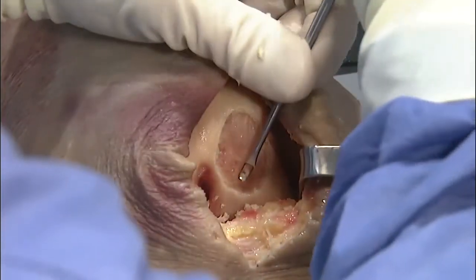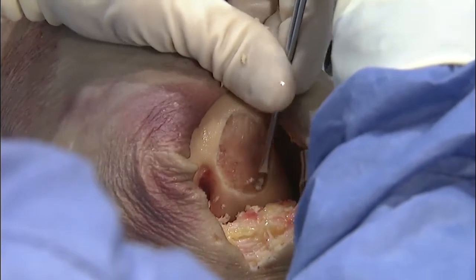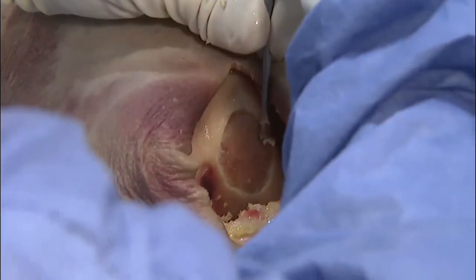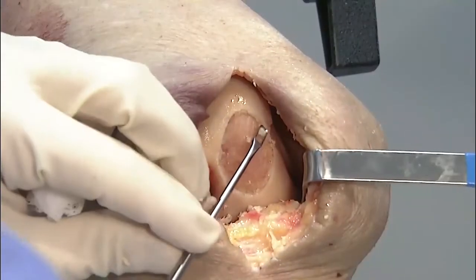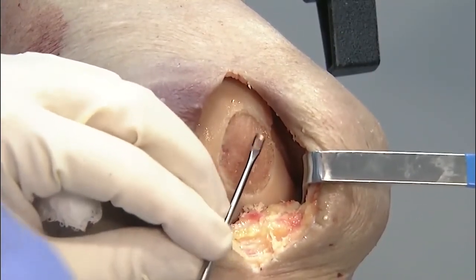The bigger your curette is, the more your force is going to be distributed, so it's generally less pressure. And so that's good to remove cartilage. Then if you use a smaller curette with the same amount of force, you'll get a little bit more pressure focused. And then you'll usually see that you can get deeper much faster. So you got to be careful you're not going too deep.